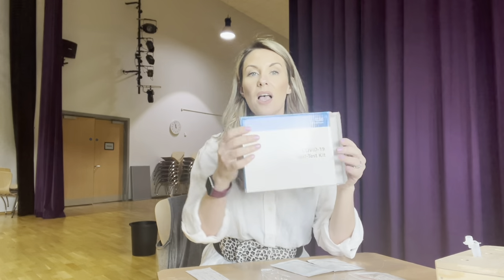Hi everyone, today I'm going to show you how you can do a lateral flow test at home with the self-test kits that we're going to give you in school.